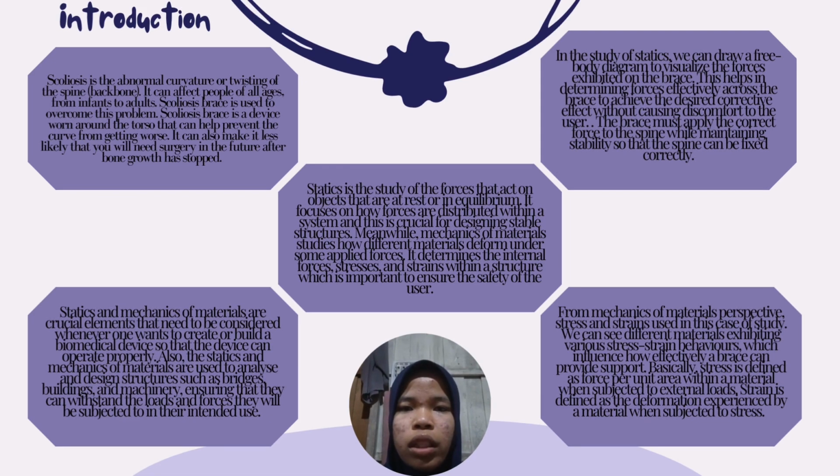In the study of statics, we can draw a free body diagram to visualize the forces exerted on the brace. This helps in determining forces effectively across the brace to achieve the desired corrective effect without causing discomfort for the user. The brace must apply the correct force to the spine while maintaining stability so that the spine can be corrected properly.